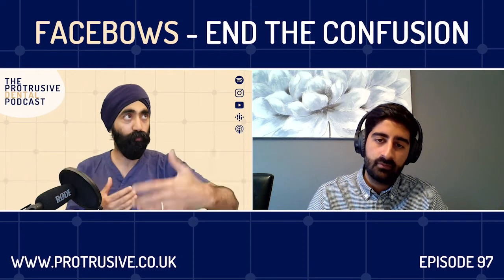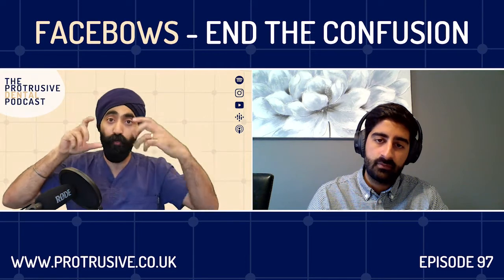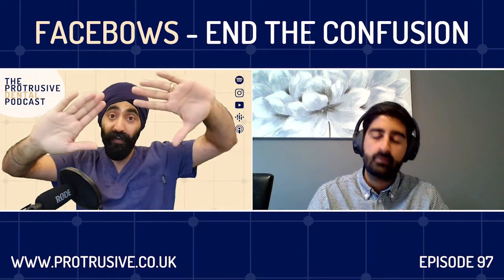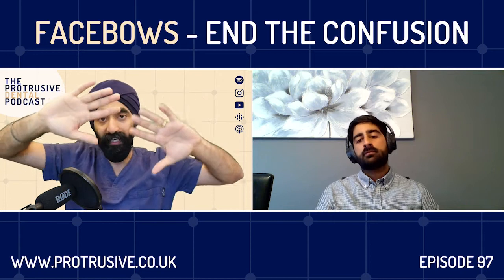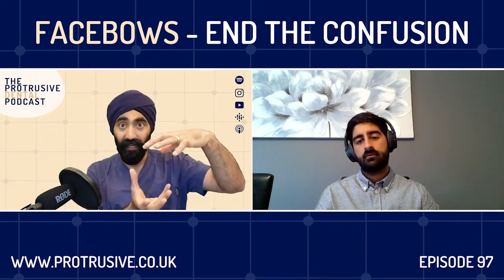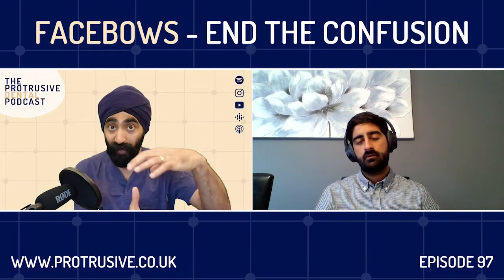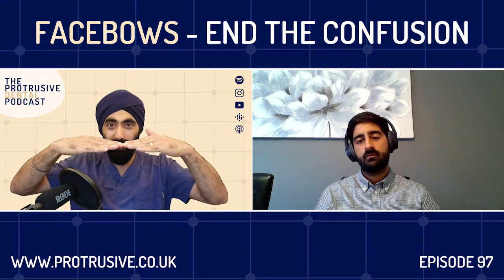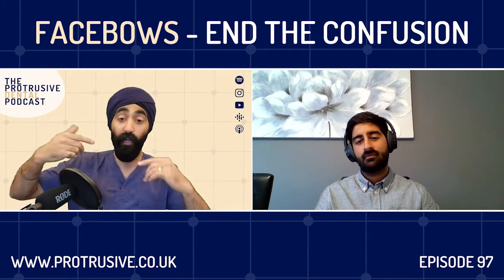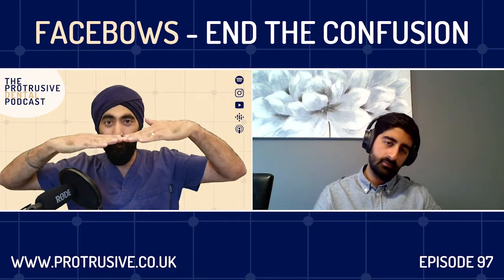And you can nowadays, on Photoshop, whatever, superimpose your intraoral photo on the facial photo and just make sure everything's correct. And by giving that level of information to the technician, as they're about to set the model on the average value articulator, they can look at your photos and be like, okay, this looks a little bit like this, and I'm going to do it like that. And then you can even give a side view, a profile view, showing, okay, this is the best guess of how it's going to be.